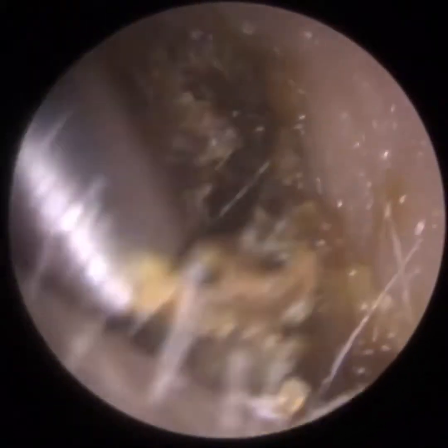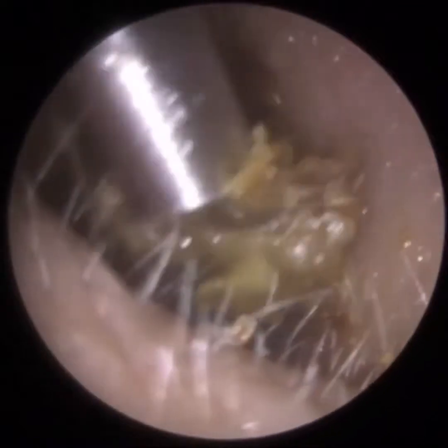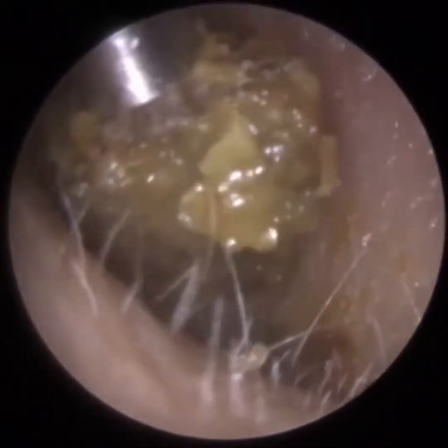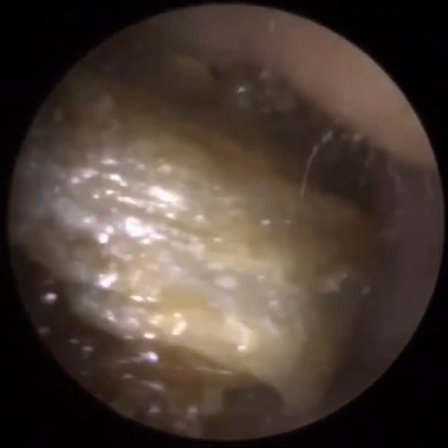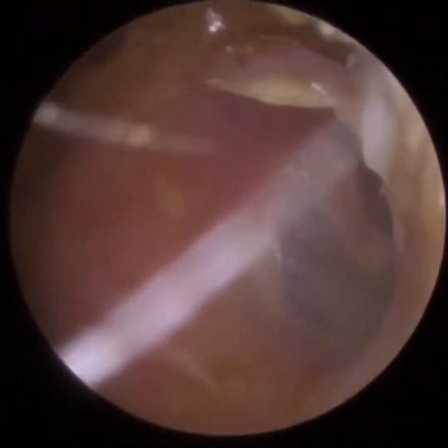You'll see I was targeting the posterior lateral canal wall. Now, with an endoscope, you can visualise that because of the field of view. With some other visualisation techniques, for example, loupes, which are like head goggles, and an otoscopic approach, you may not see that, so it's a bit more tricky.